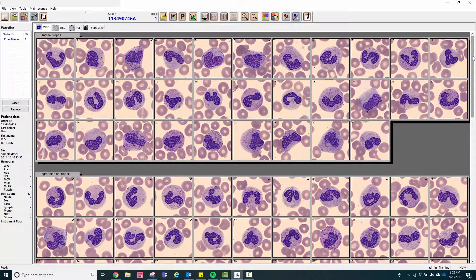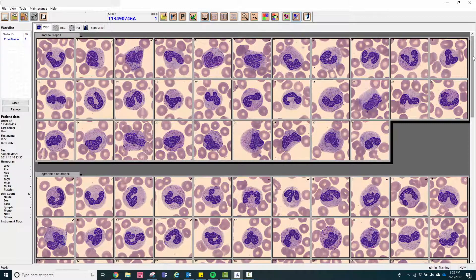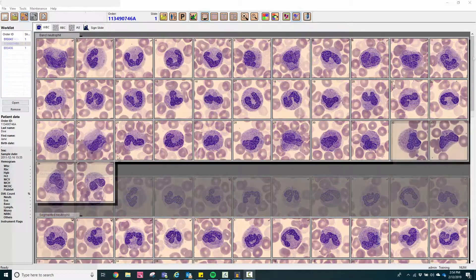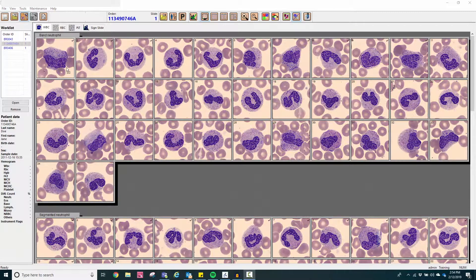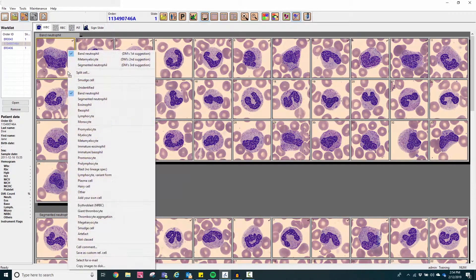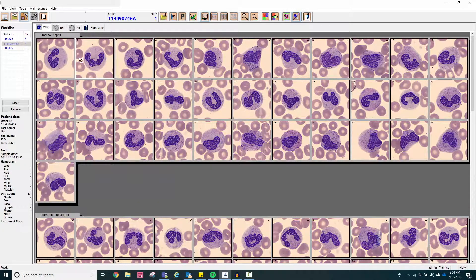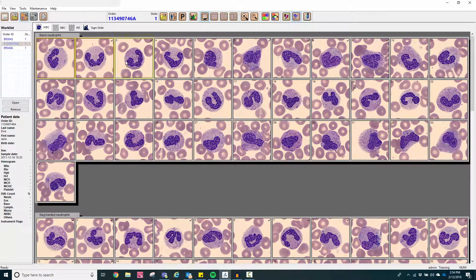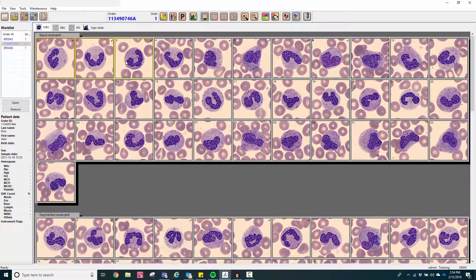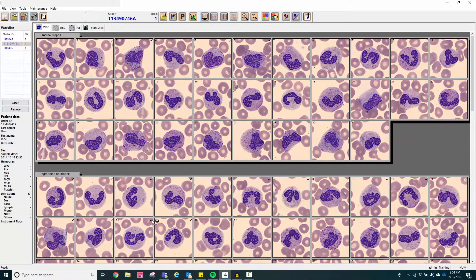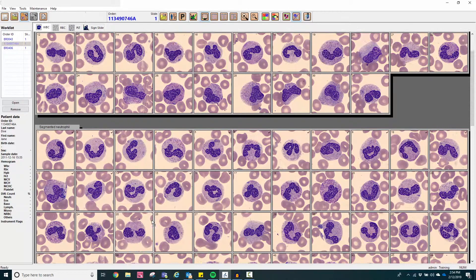This particular system offers first, second, and third choice selections based on an FDA-approved knowledge-based algorithm. The technologist is able to reclassify cells based on his or her morphologic assessment.